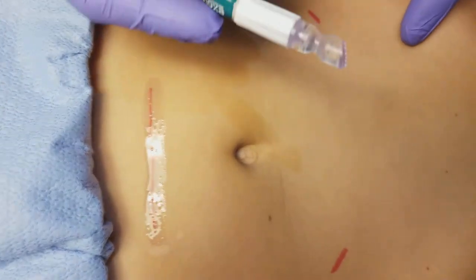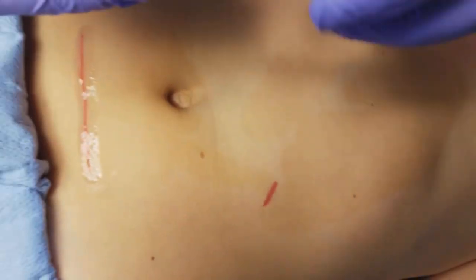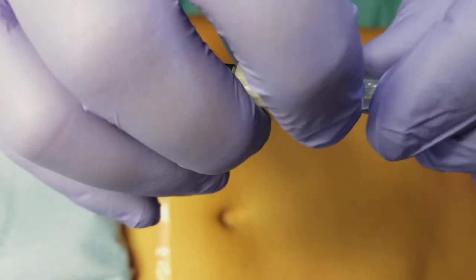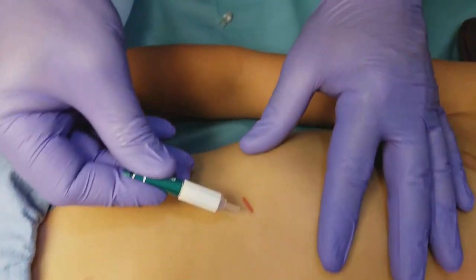For laparoscopic applications, you can still use the larger brush tip, but there is a small tip inside. You crack it down, it breaks loose, and you can remove it — it has a fine point tip.